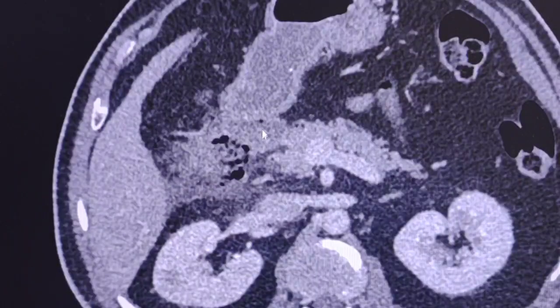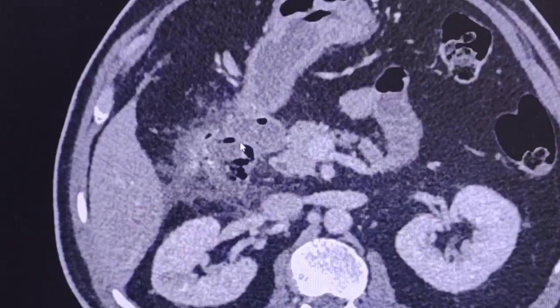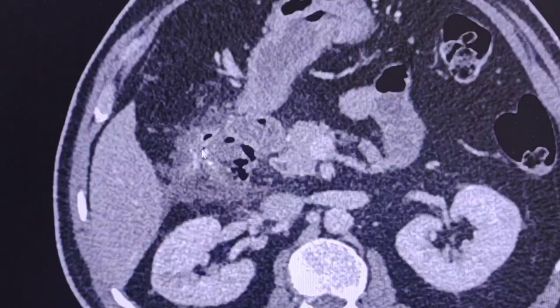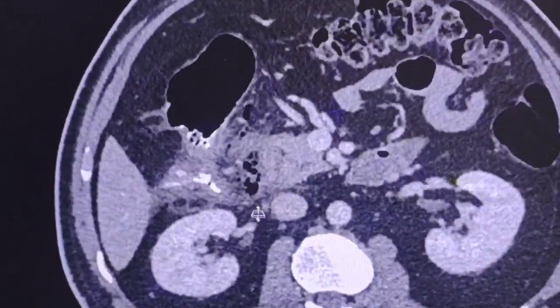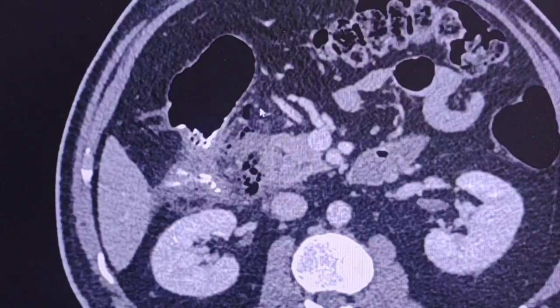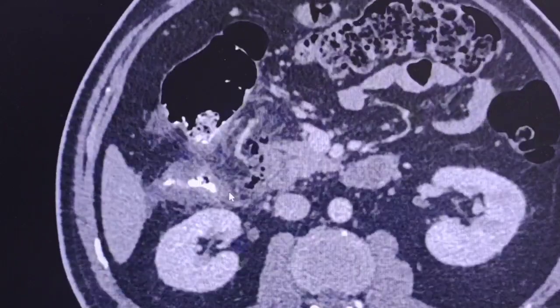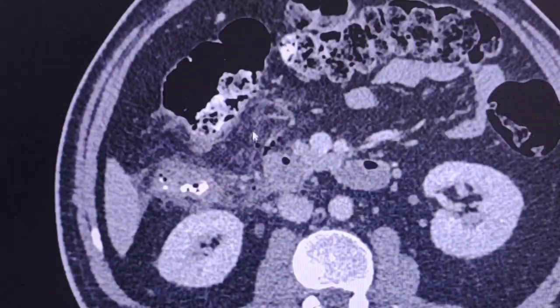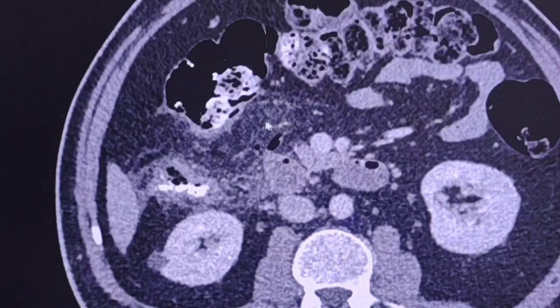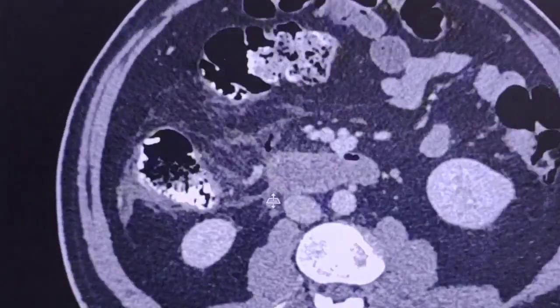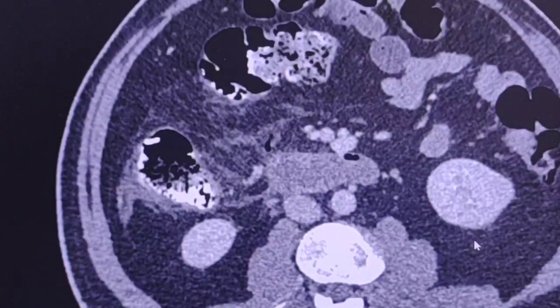Let's look again at the duodenum, which shows irregular wall thickening, mural edema, and as you can see there is significant fat stranding surrounding it with some traces of fluid. There is blurring of the fat tissue around the duodenum compared to the rest of the abdomen.